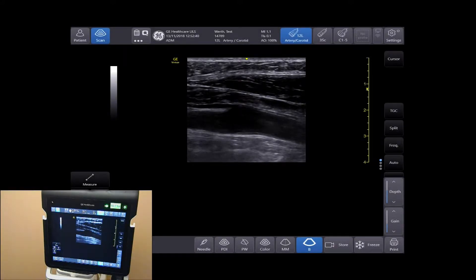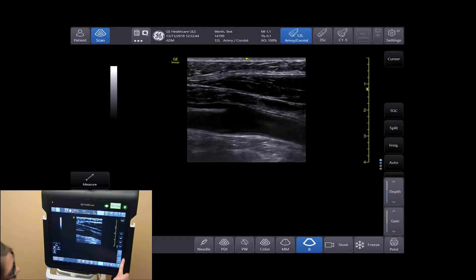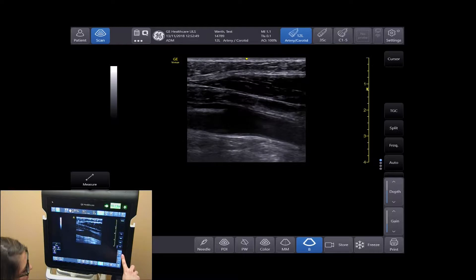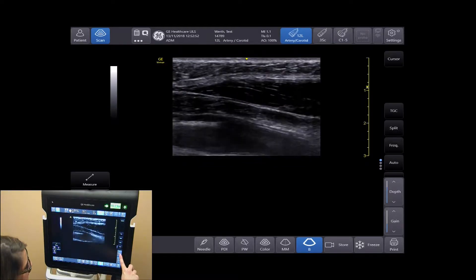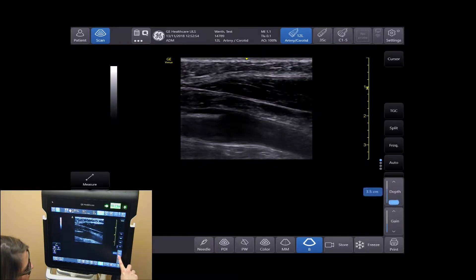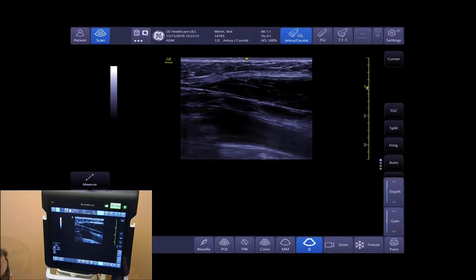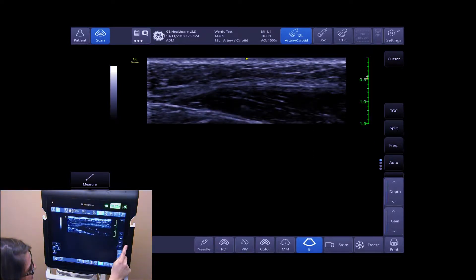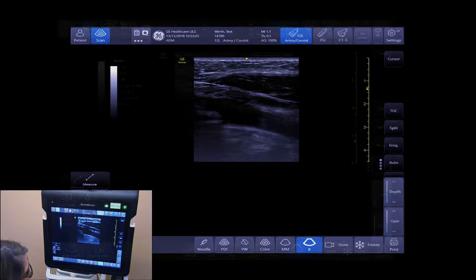Optimizing your B-Mode image. To adjust your depth, tap on the up and down arrows on the right-hand side of your screen where it says depth. You can also adjust your depth by sliding your finger up and down your scale on the right-hand side of your screen.